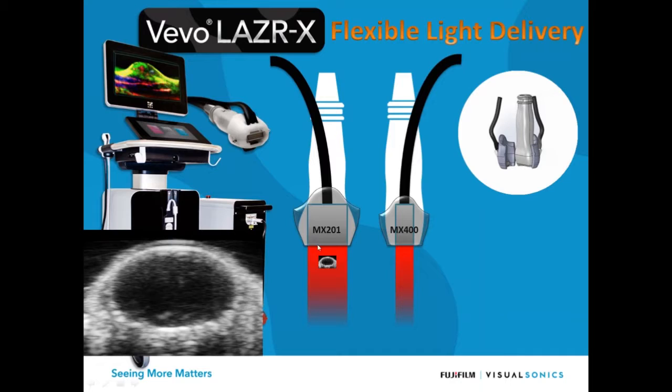So let's use the MX201. This is a 15 megahertz probe. So I actually want to use this probe to see through the skull and get better sensitivity. But now I'm using a fiber that extends across the whole range. So essentially what I'm doing is I'm throwing away about 2/3 of the laser light. About 2/3 of the light isn't even getting into my target. And I'll still get an image. I might get an image of something like this. This is again that oxygen saturation parametric map image that you're seeing here with red being higher oxygen saturation.